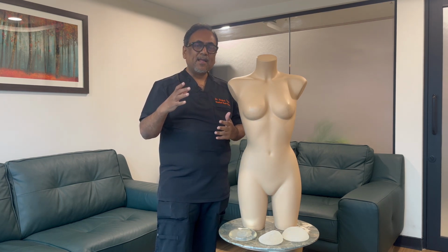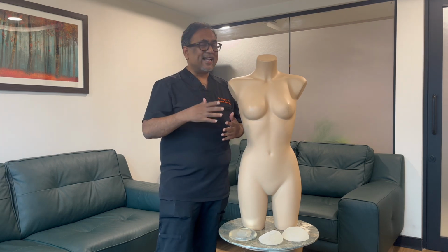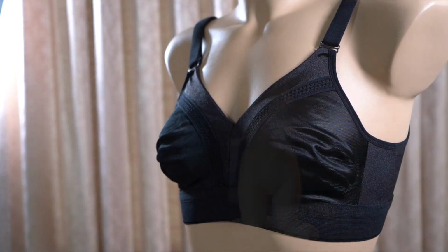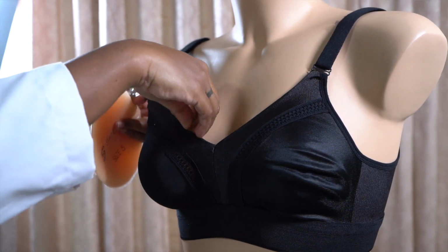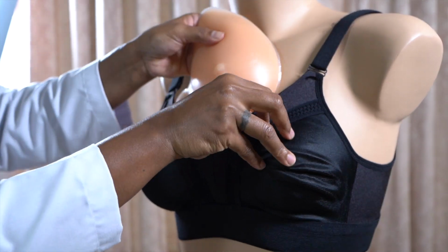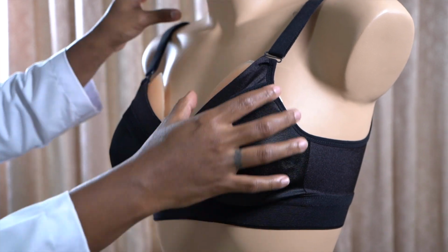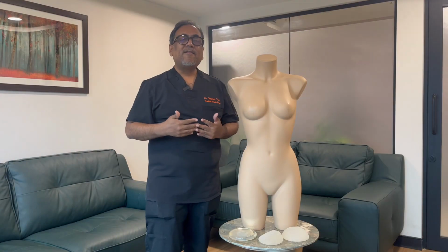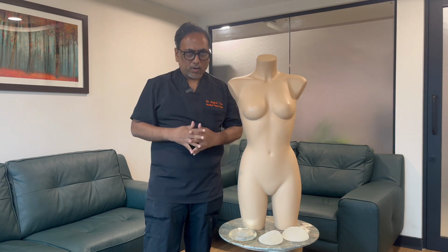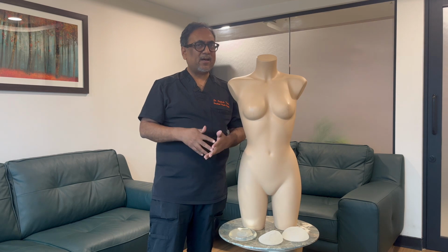So we get an idea, and we also have what is called an external sizing system, where the patient is made to wear an implant in the bra. Based on the dimension of the implant which we get by measuring the base diameter, that particular implant is put in the bra, and the patient stands in front of the mirror and sees for herself whether that is suitable or not. Now, there are two possibilities. The patient either likes it or doesn't like it.